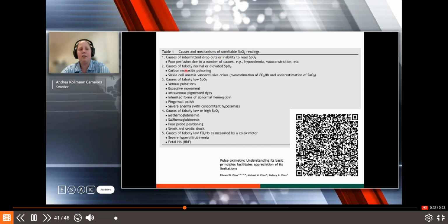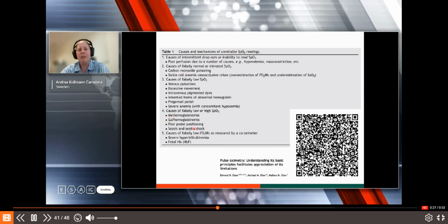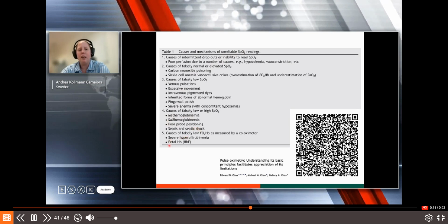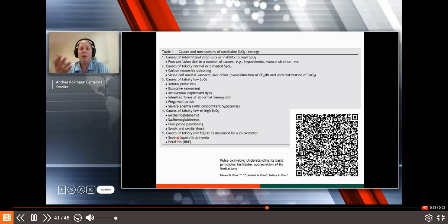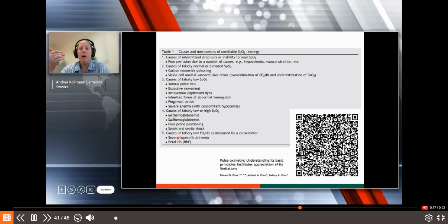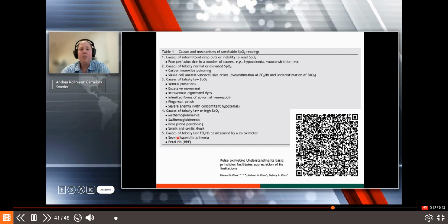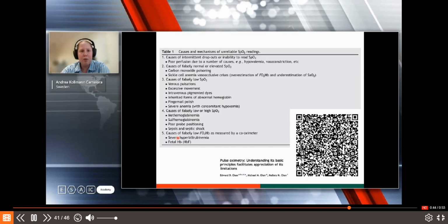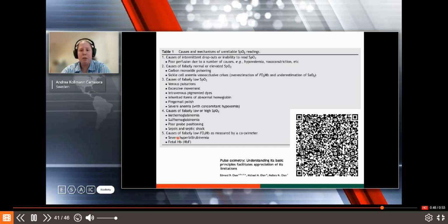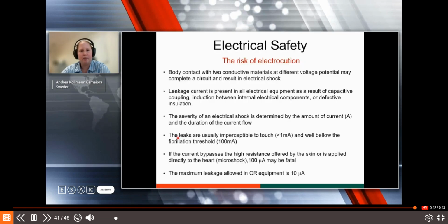It talks about, for example, methemoglobinemia, patients with septic shock, and how fetal hemoglobin affects it, because there are other hemoglobins, not just oxy and deoxy, that can affect the measurement of the wavelength. So what I've told you plus this table is enough for part 1 and part 2, but if you want to know more in depth, I highly suggest this article.